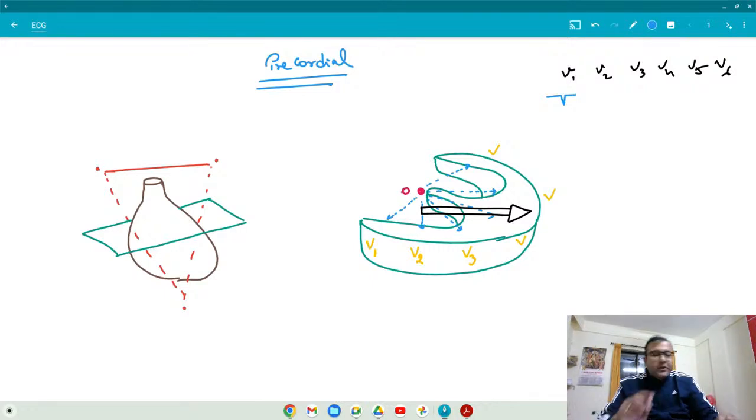Okay. So you tell me, are you looking at the head for a longer duration or looking at the tail for a longer duration? When the train is going like this, we see the tail more, that means the positive deflection should be tiny and the negative deflection should be bigger. Yes or no? Okay, that means I can say a tiny positive deflection and a bigger negative deflection like this.